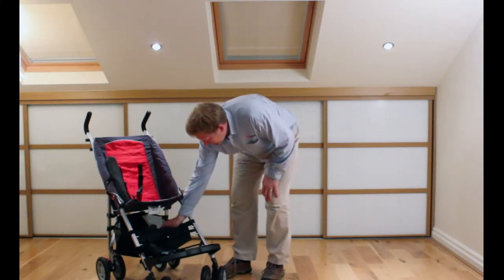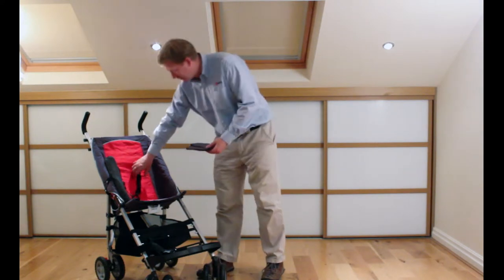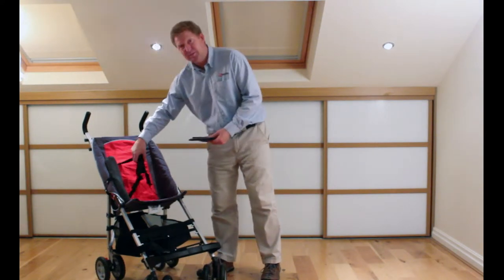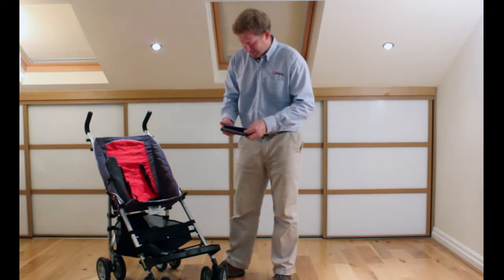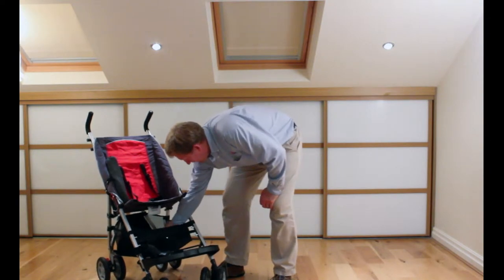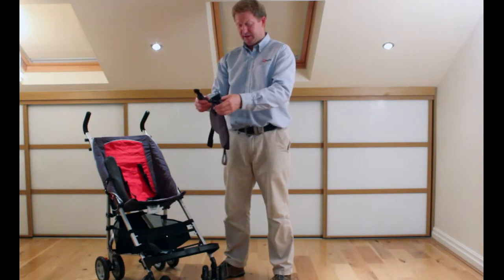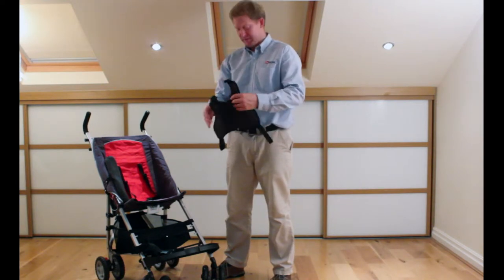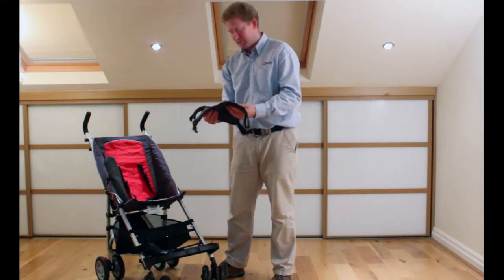We've also got a chest pad just to help keep the straps together if they're tending to take them off, or just to keep the straps on. There's a more substantial chest pad as well — if they're leaning quite heavily into the straps you can put this over the top to add a bit more support.